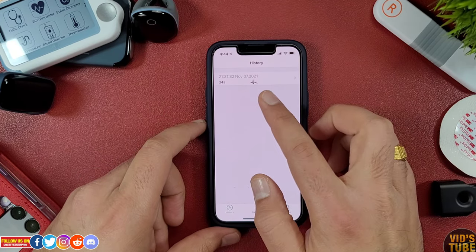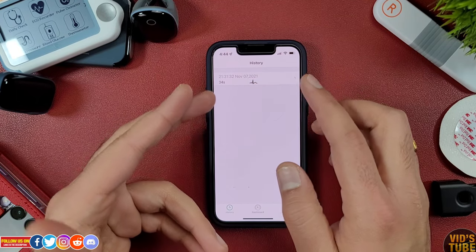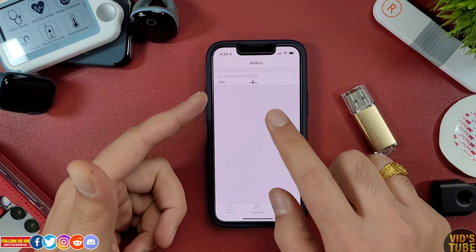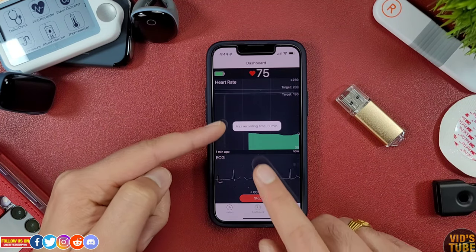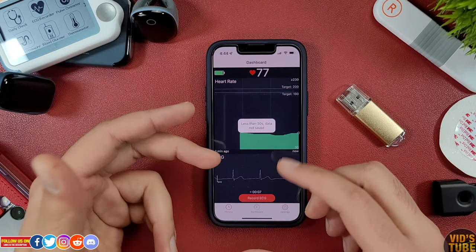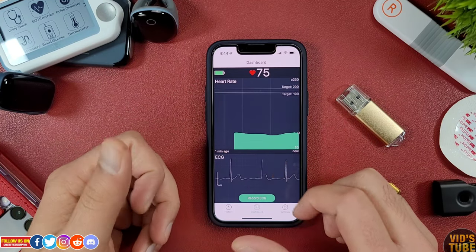Under history, you will find the recorded data. However, this data is not the AI ECG data, as that can only be accessed from the PC or Mac application. This data is what you can manually record from the dashboard when you press the record button. So for this AI ECG recorder, the mobile app is just to see real-time data and record a short 30-minute ECG recording.